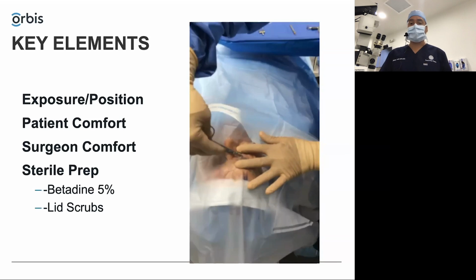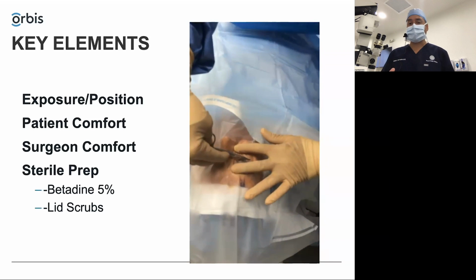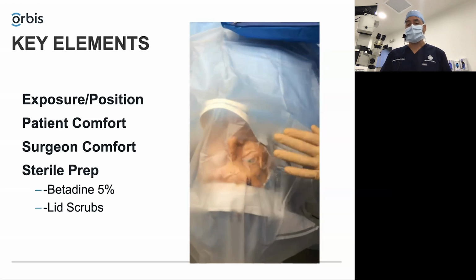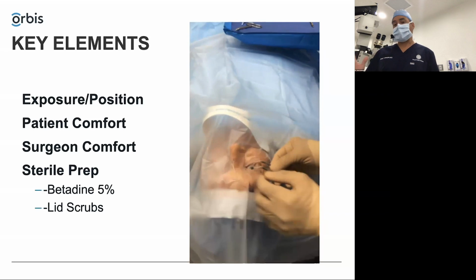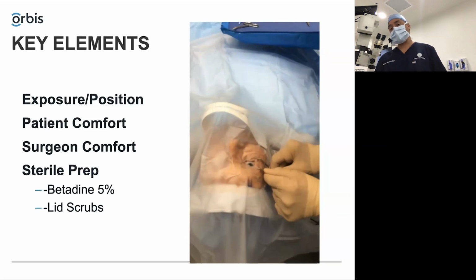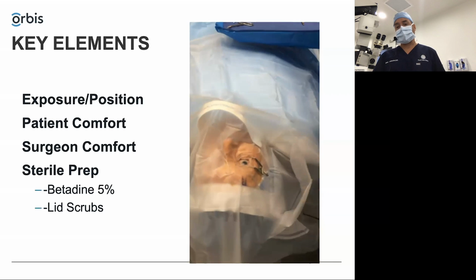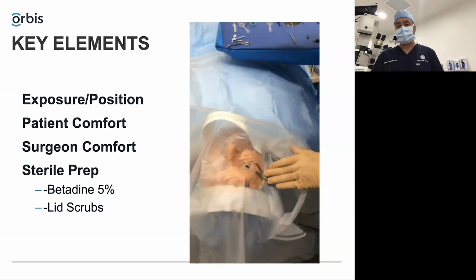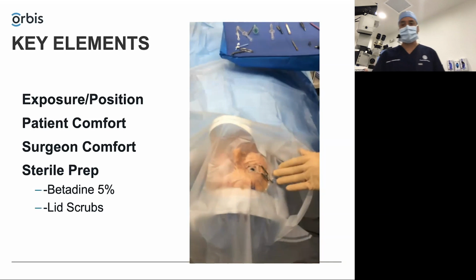The patient needs to be laying flat. The eye has to be nicely exposed. The lashes have to be out of the way. The eye has to be prepped with betadine. And I like the head to be tilted slightly to the surgeon since I operate temporally, so that fluid falls out over the cheek instead of pooling in the medial canthal area. So there's a good view of the technician prepping the patient in that scenario. So again, critical that you're comfortable.